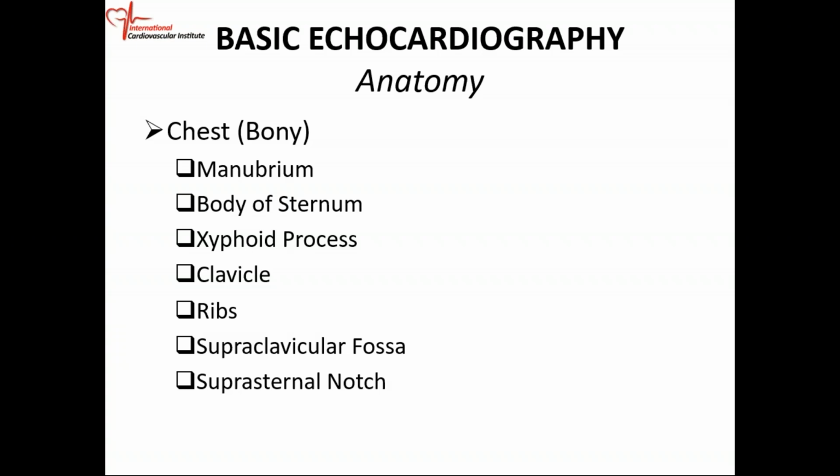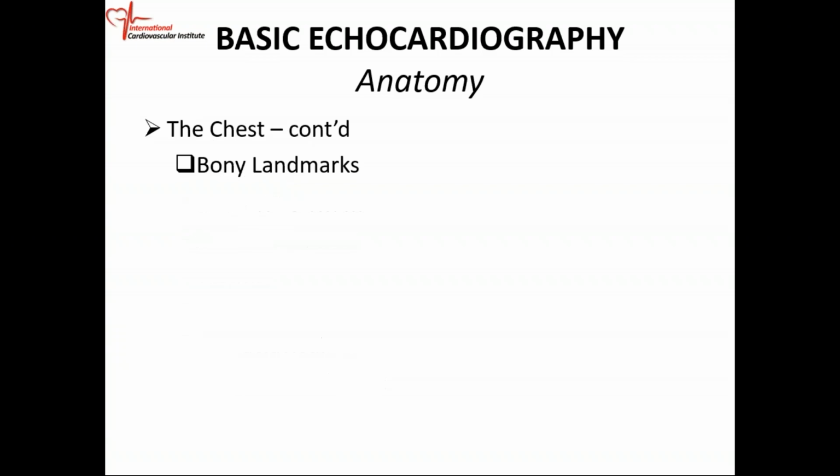We're going to talk about the supraclavicular fossa. And the reason why we're going to talk about the supraclavicular fossa is because we do a lot of scanning there. We take a lot of pictures from the supraclavicular fossa and then also the suprasternal notch. So you have to know those two landmarks.